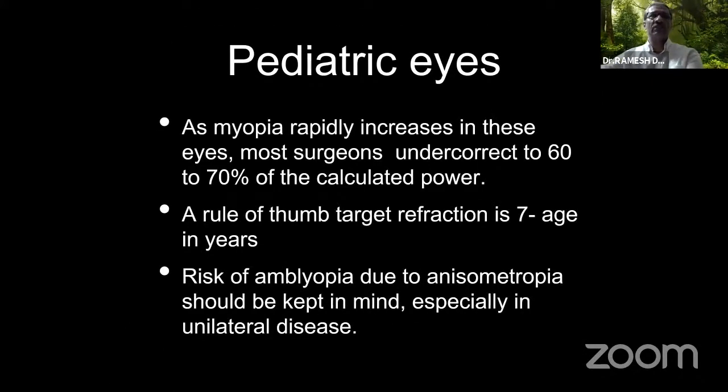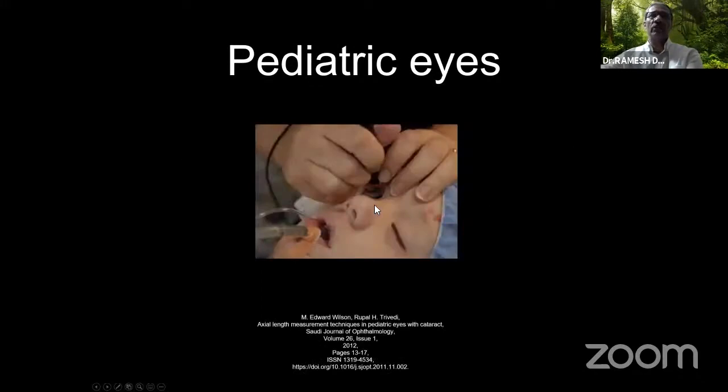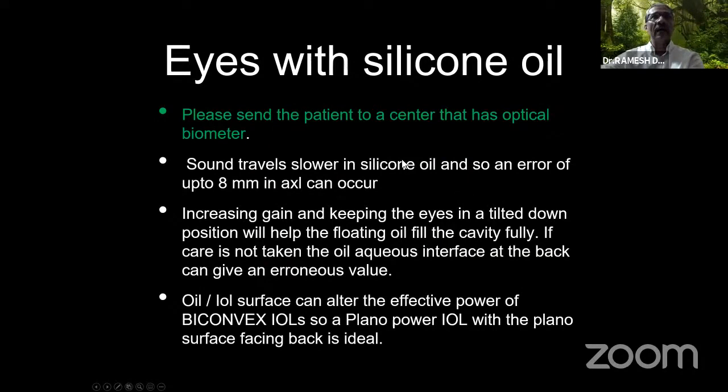Pediatric eyes are a challenge, and part of the challenge is trying to get measurements under GA in these patients. Eyes with silicone oil are also atypical. Please send the patient to a center that has an optical biometer. This is the best thing that you can do.